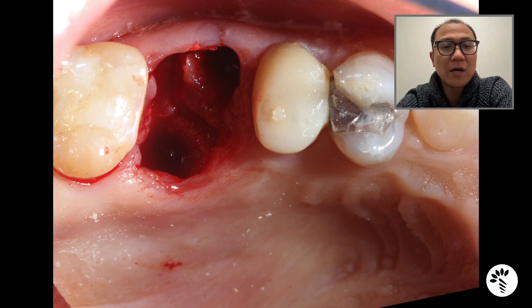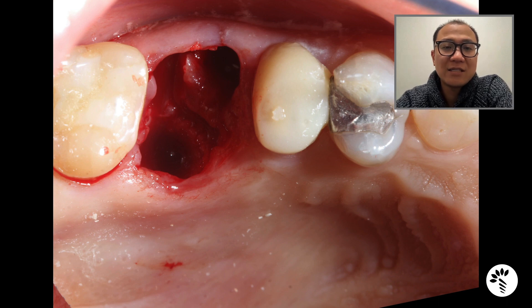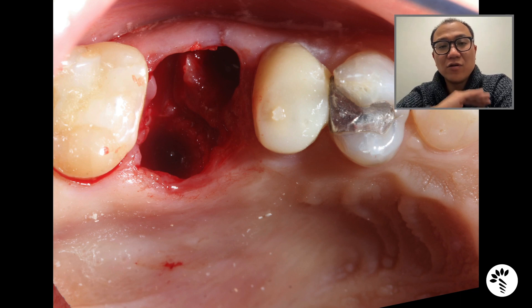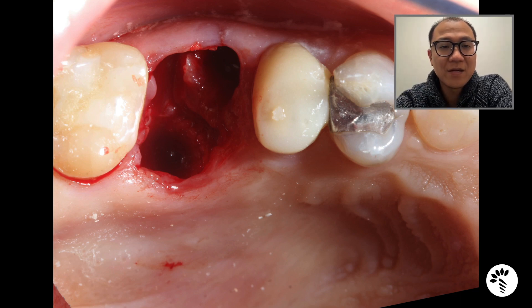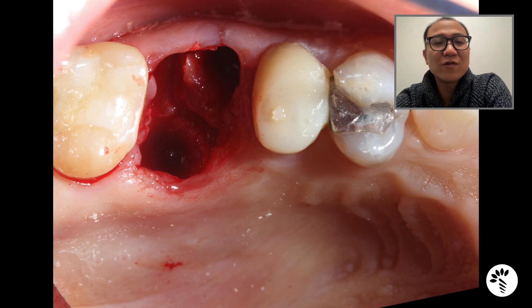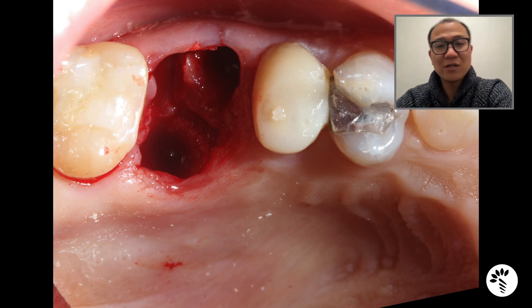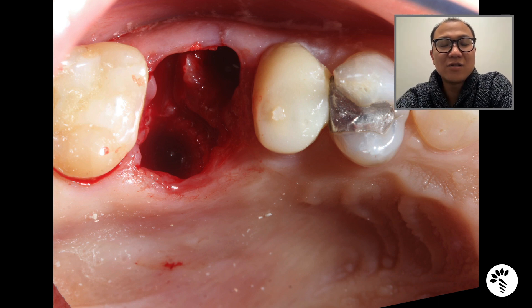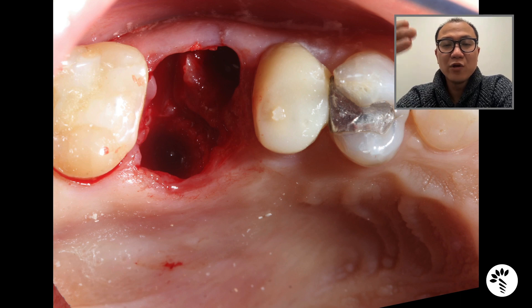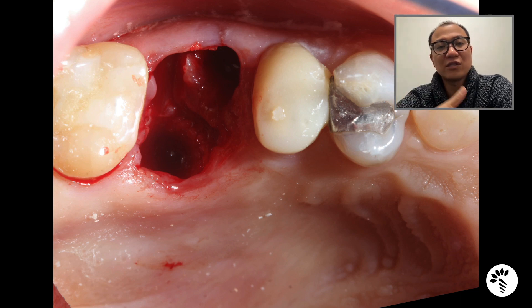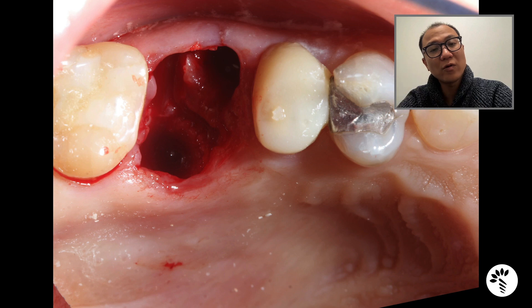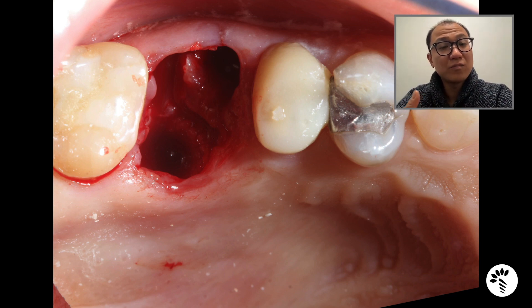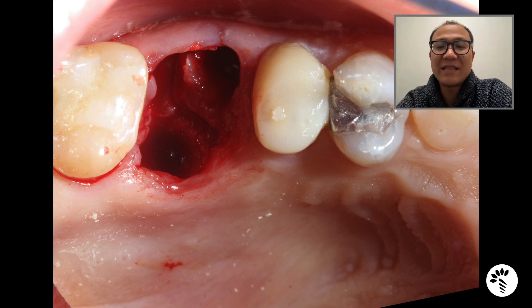You can see a little bit of bur mark around the alveolus. I started cleaning the socket completely, and when cleaning I realized there is a huge buccal dehiscence in the area. Whenever you see a buccal dehiscence, you want to repair it. So I elevate the flap in a way that I can manipulate the tissue to close the socket completely — I'm not only doing horizontal augmentation but also some vertical augmentation, and I prefer to achieve primary closure in this case.